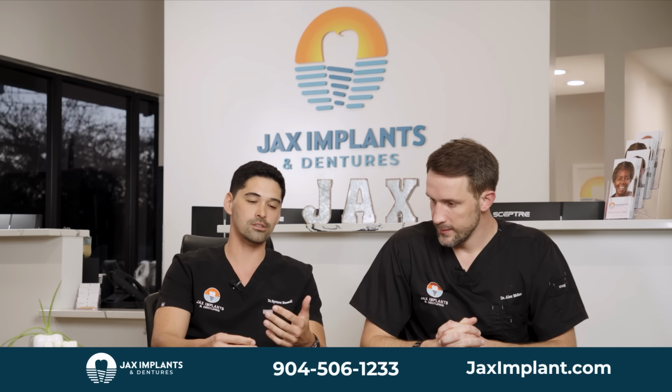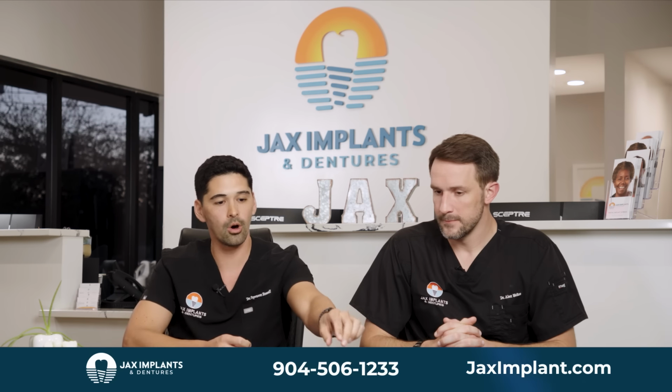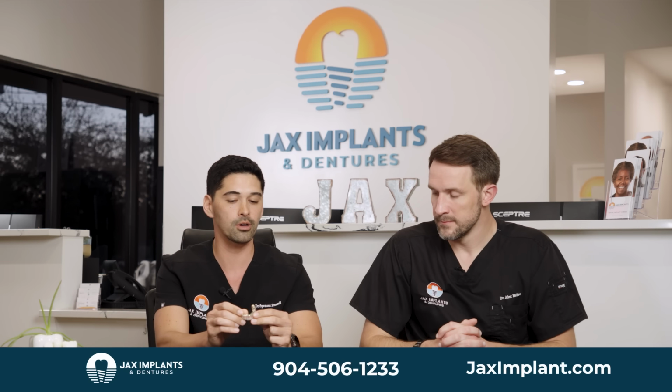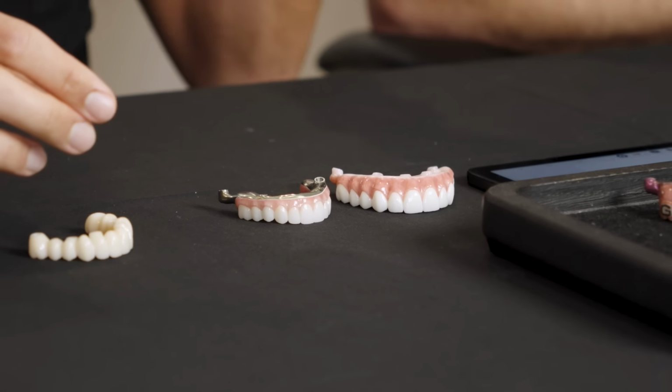So if you're having this procedure done and you're talking about your permanent materials, the thing you definitely want in your permanent material is zirconia, for sure. Whether that is monolithic zirconia, all one piece, 100% zirconia all the way through, or zirconia on top of a titanium bar. If I was having this procedure done and getting my permanent teeth, I would want one of these two options.